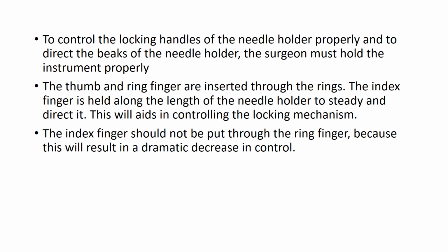To control the locking handle of the needle holder properly and to direct the beaks of the needle holder, the surgeon must hold the instrument properly. So how to do it? The thumb and the ring finger are inserted through the rings of the handle. The index finger is held along the length of the needle holder to steady and direct it. This will aid in controlling the locking mechanism.